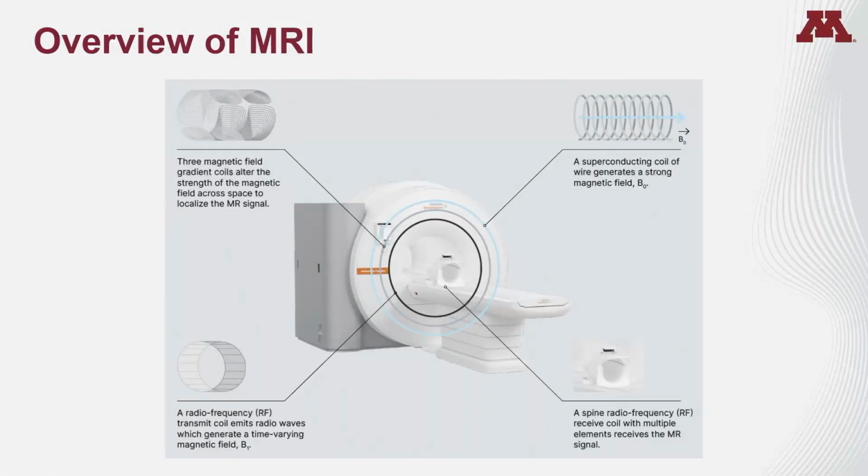So this is what the scanner's looking like right now. So industry's taken the position of they're making a step forward into the dental market. They're using existing technology and tailoring it to see how dentistry responds to it, as they have now, it being tailored for them, to figure out what their next step is.